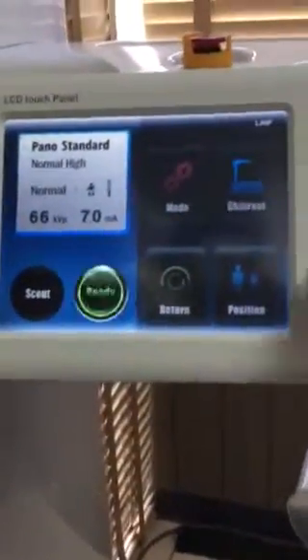The laser lights timed out. There's one other thing that you can use this for: position. And here it's also a little light bulb icon. When you guys are taking images of patients, after a while, you'll be bam, boom, bam. It won't even have a chance to time out. But as I'm talking here so much, they will time out.